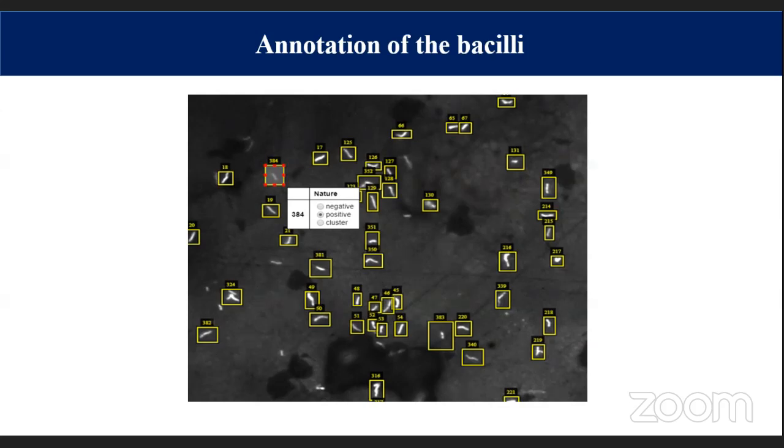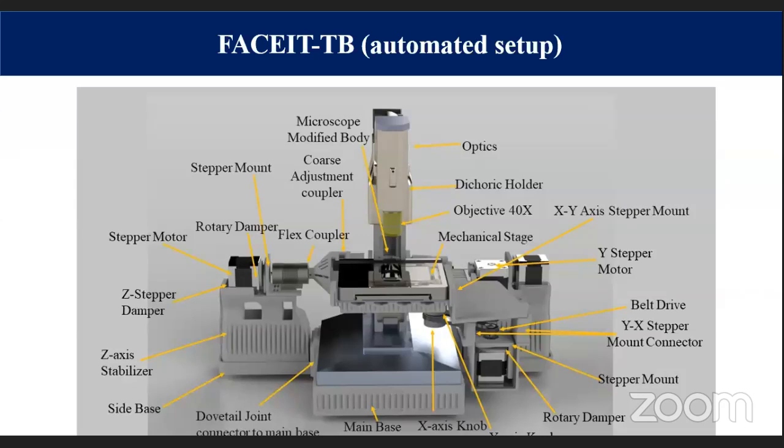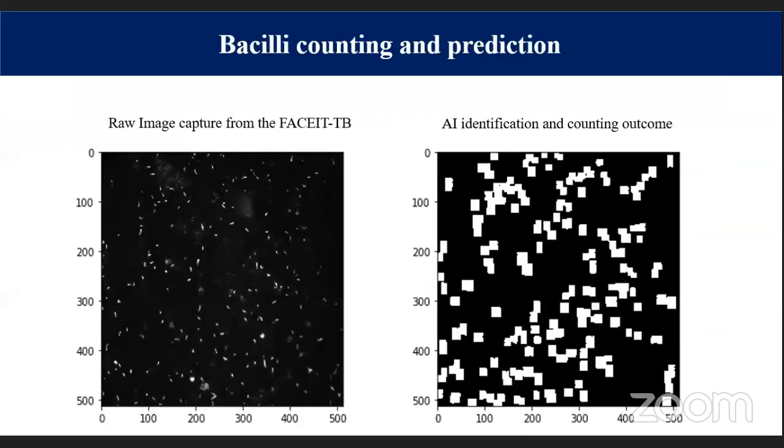So in this way, we are not only making the system more sensitive but also adding a surveillance aspect, because most of the time people do not know how many patients are getting checked, or what the numbers and outbreaks are in certain areas. Such a central server based surveillance system might help in observing and better managing the disease. So you can see how artificial intelligence is counting and making it more efficient.